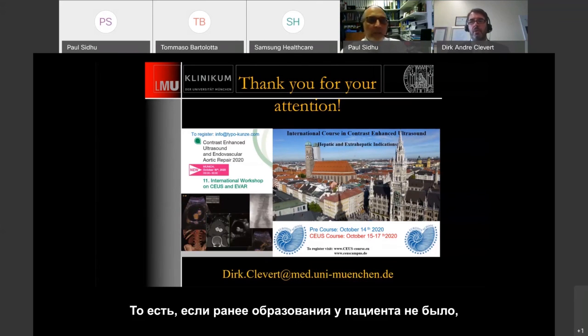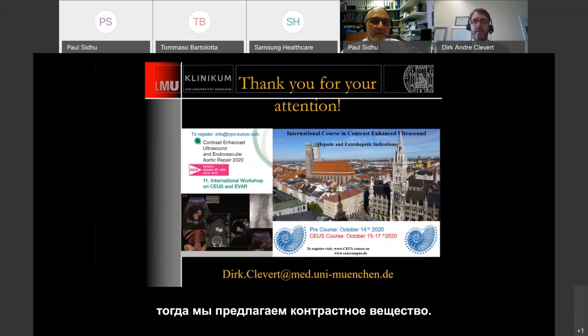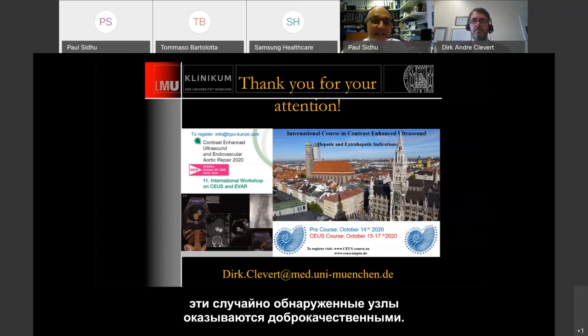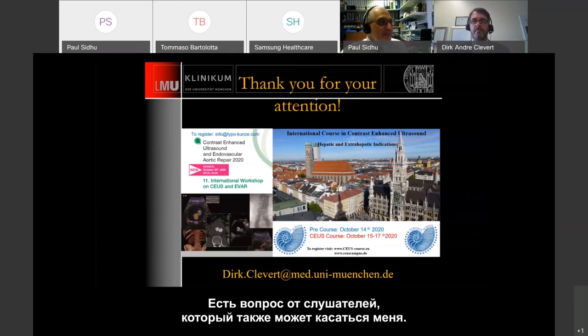So if a lesion was not known in the past and it doesn't look like a typical benign lesion, then we offer the contrast agent. And this is very reassuring for the patient, of course, that you can give them the diagnosis straight away. Straight away, no waiting time. And very often, nearly 80 to 90% of the time, these incidental lesions from primary care are benign. That's absolutely correct.